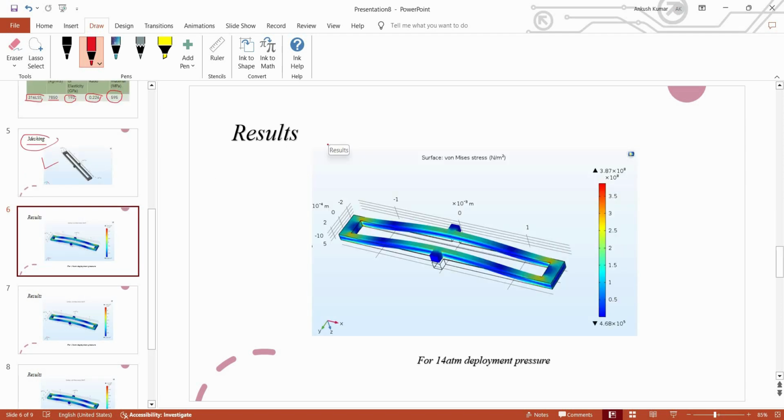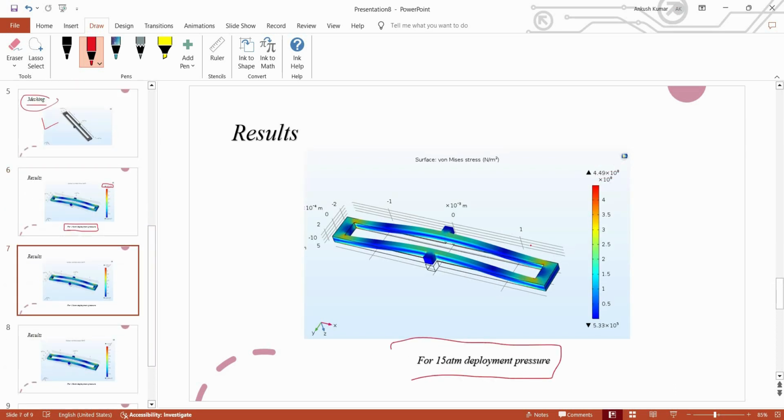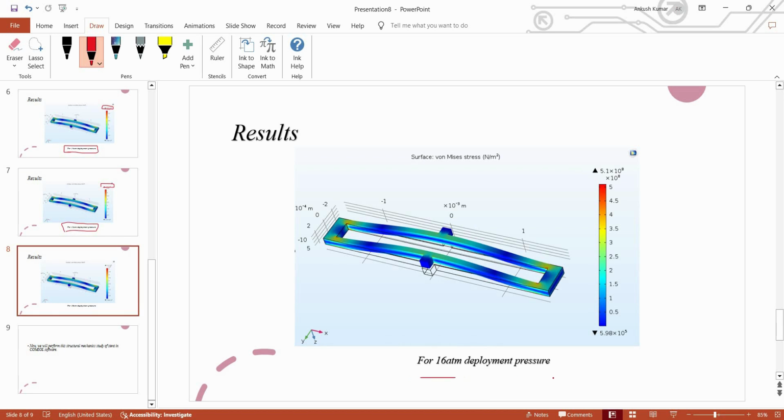After computing the results, we got these results. This is the von Mises stress at 14 atm deployment pressure. We got 3.87 × 10^8 pascal stress, and for 15 atm deployment pressure we got 4.49 × 10^8 pascal, and for 16 atm deployment pressure we got 5.1 × 10^8 pascal. These are the maximum stresses which we got after performing this structural mechanics study in COMSOL software.